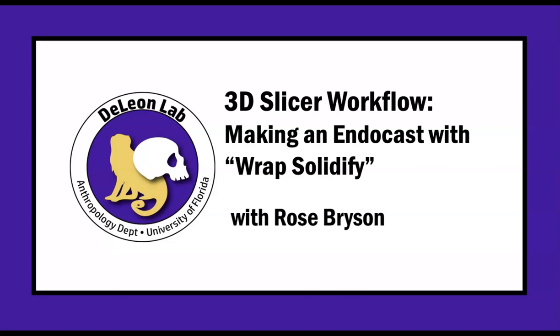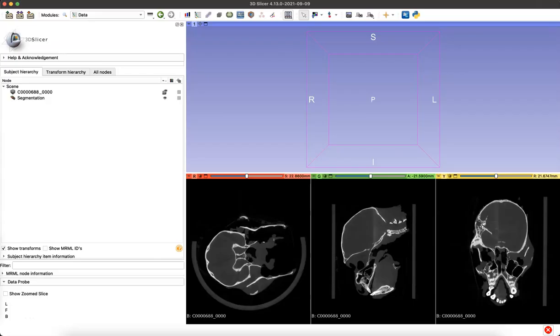Endocasts are a representation of the endocranial space within a skull, so they can help researchers study the brain space when all that's left of an animal is its bones.